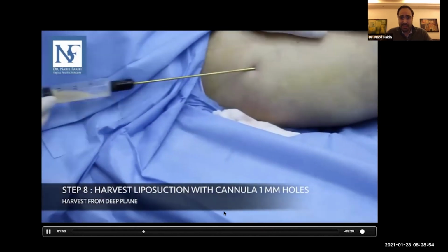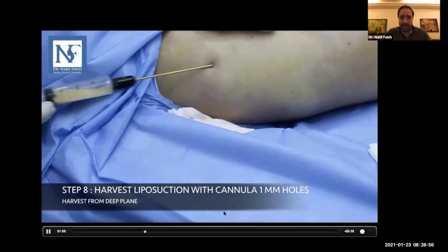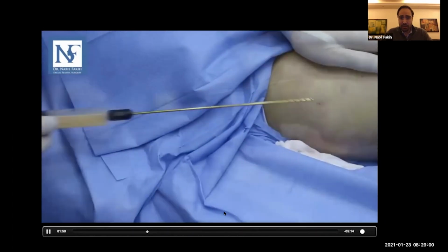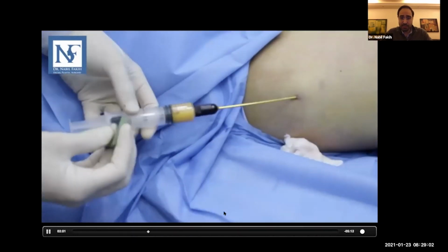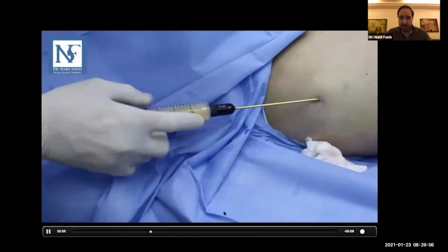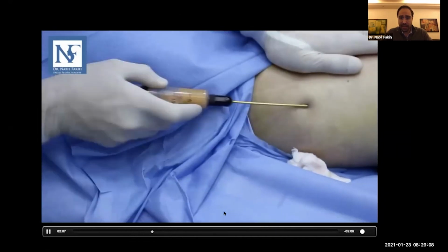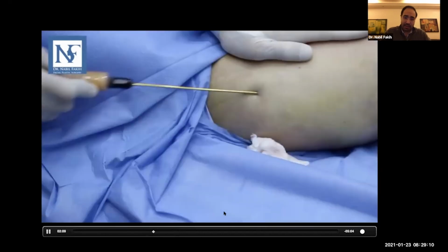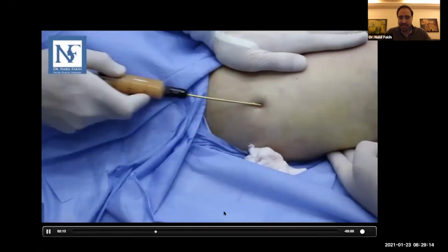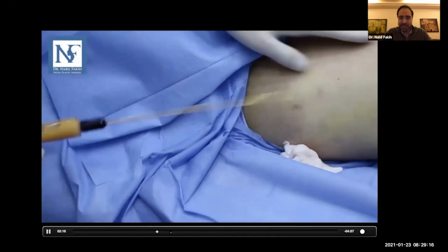We start harvesting. Okay, so from the area you want to harvest, remember that this area is a bit tricky. If you want to suction more, this is not the best position to harvest, because you can create a dipping in the area. Okay, it's better flipped sideways. But since I'm just harvesting very little, I'm just showing you exactly what we do.